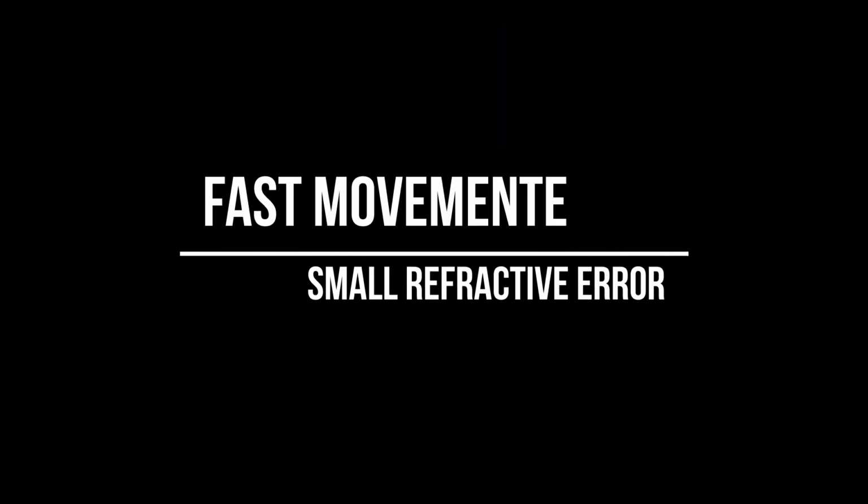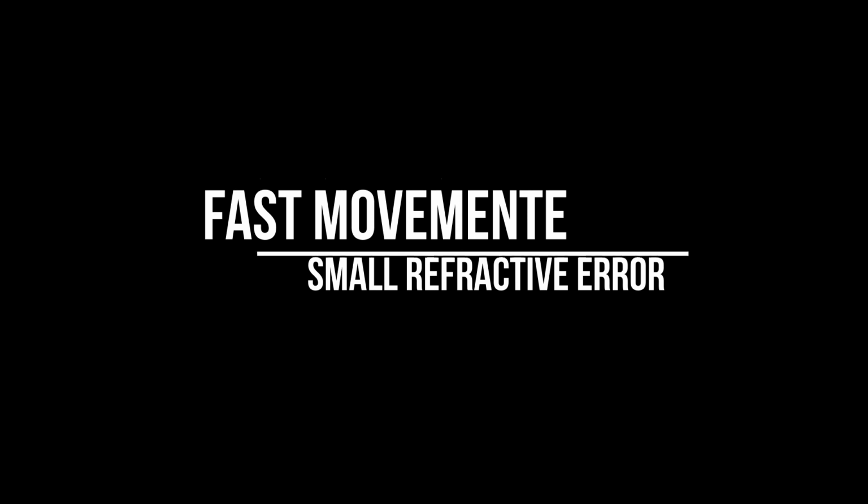Also note that for fast movement, which means the error is very small, use smaller power steps, for example minus or plus 0.5 diopters. Then for slower motion, use greater steps because the error is big. You could probably start with plus minus 3 instead of going for smaller ones of 0.5, because then you would take a lot of time, get tired, and make the patient quite tired. So be sure what you start with depending on the size or the power of the refractive error.